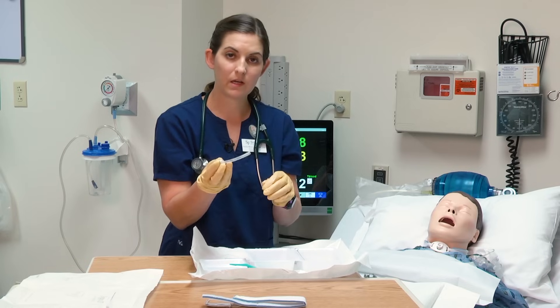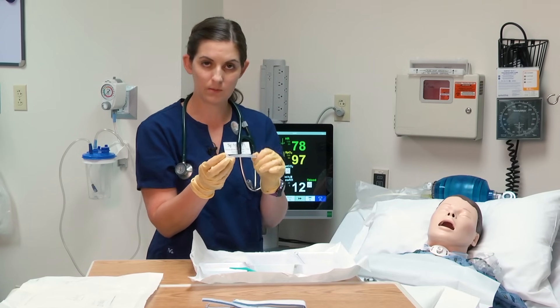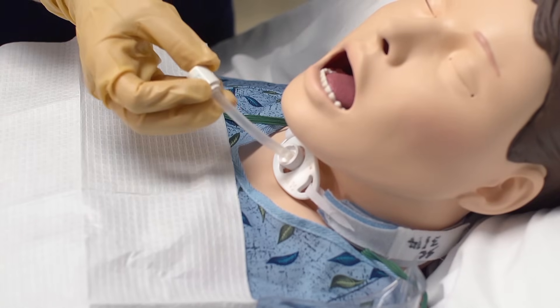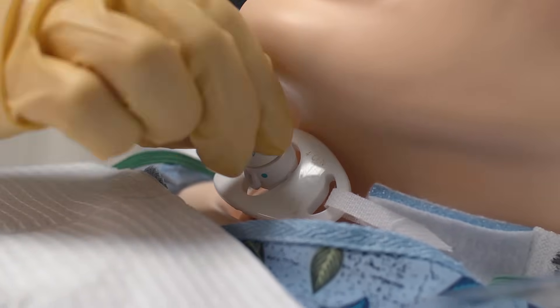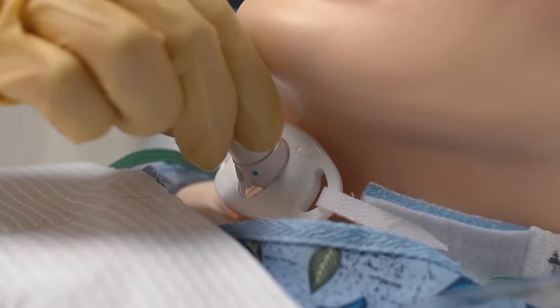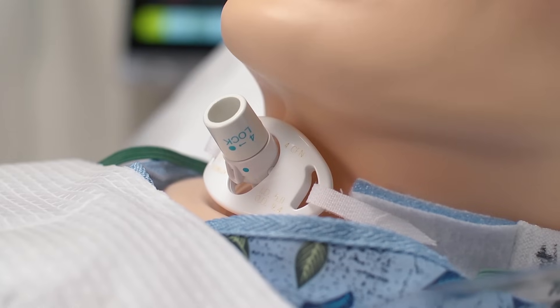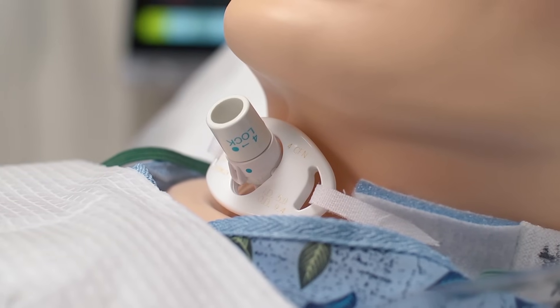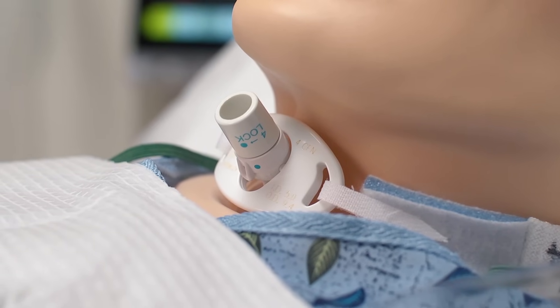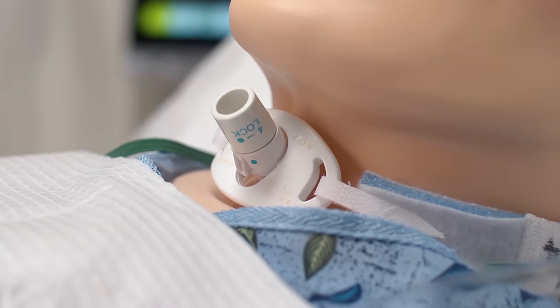We are now ready to replace the tracheostomy tube into the patient. I'm going to replace the inner cannula and lock it in place — you want to turn the tube until it locks. On the tube there is a blue dot on the inner cannula and a blue dot on the part in the patient; you want to match those up to confirm they are locked. You can also feel and hear a little click when it clicks into place.